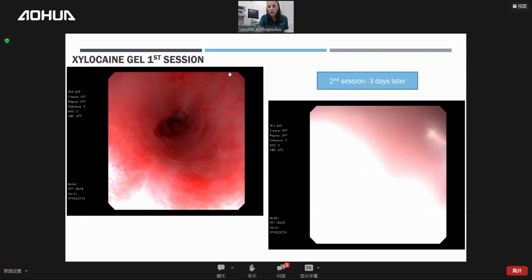Without x-ray, Diane, please explain on that. Yes, we do the balloon dilation without an x-ray, with endoscopy. We don't need an x-ray. If you mean a barium study, yes, you can do that, but then you will need a lot of days. You will always do your barium after your endoscopy, not before your endoscopy.